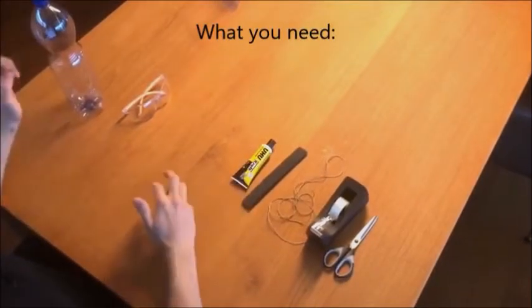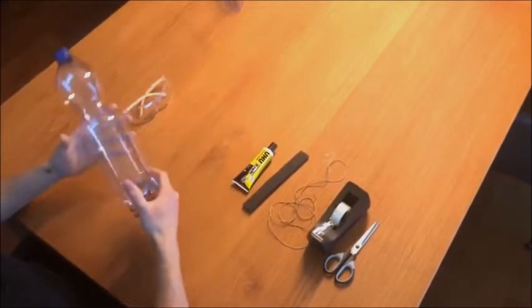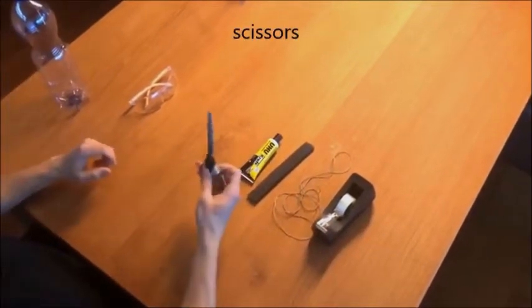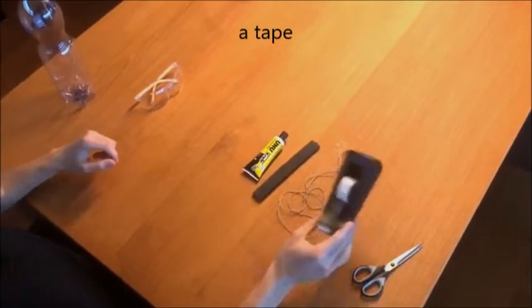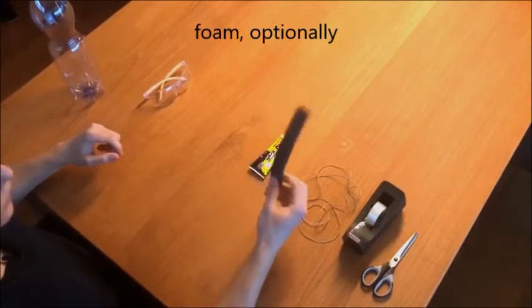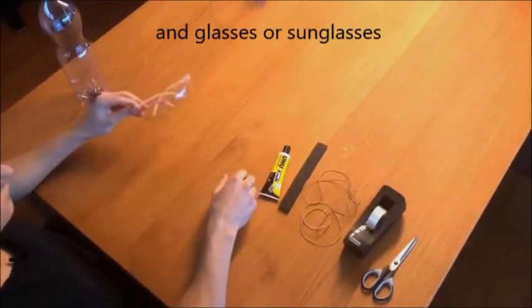Here is what you need: a large pet bottle, either 1.5L with a large flat area, scissors, tape, cord, foam optionally, and if you use foam also some glue, and glasses or sunglasses.